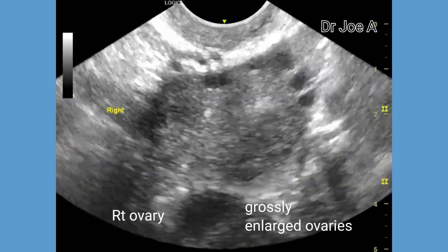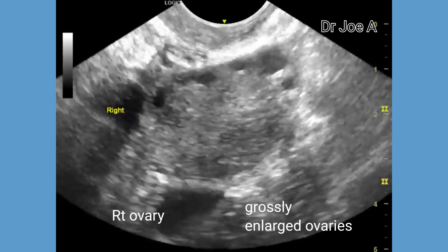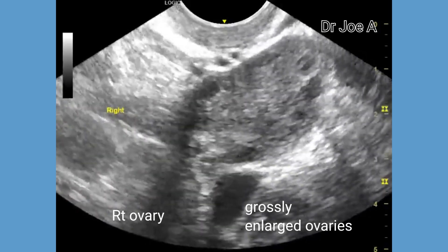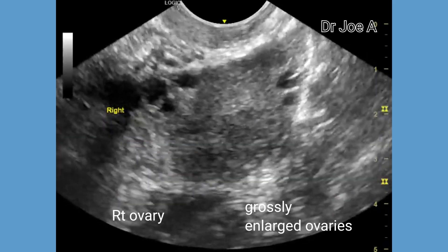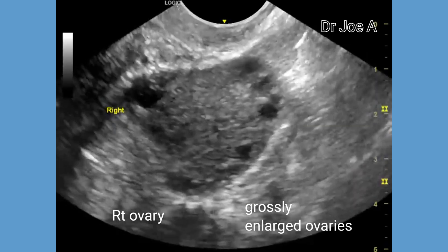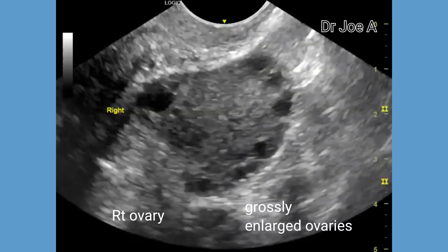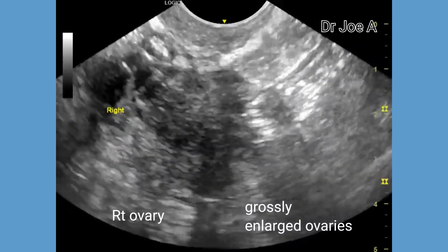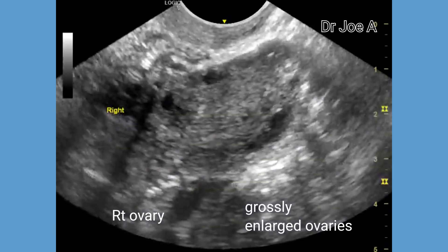The right ovary also appears grossly enlarged at more than 16 cc, with multiple peripheral follicles giving it the classic string of pearls appearance. Similar changes are seen in both ovaries.